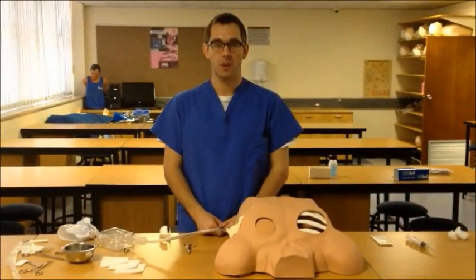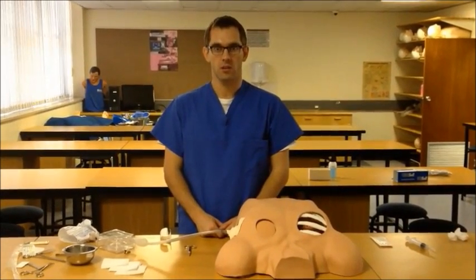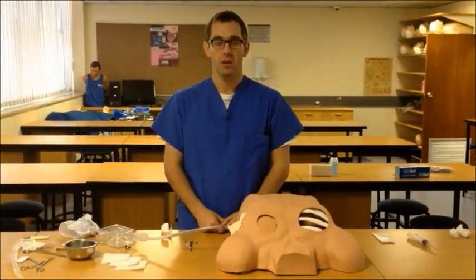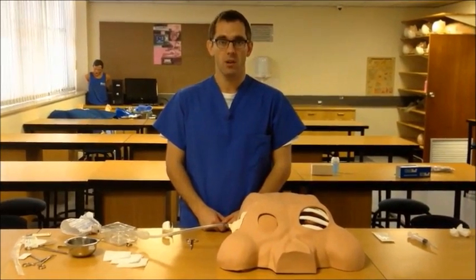Hi, this is Almeeric Westhazen with Cape Town Emergency Medicine, here today to show you removal of an intercostal drain. This instructional video builds on a previous video showing insertion of an intercostal drain. Please view that video before this one.